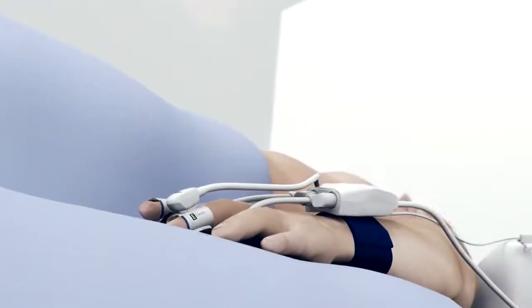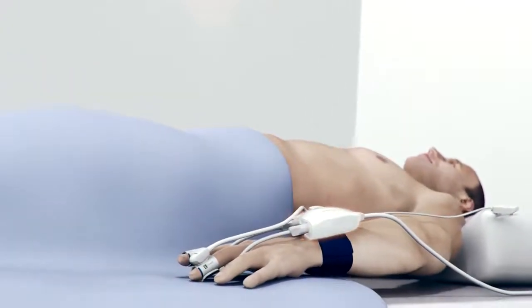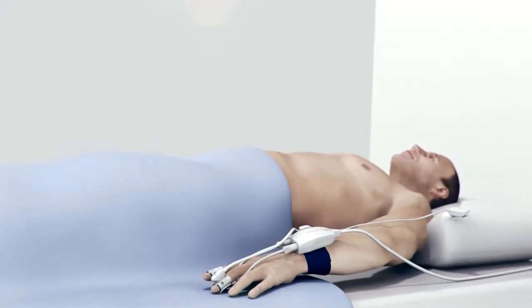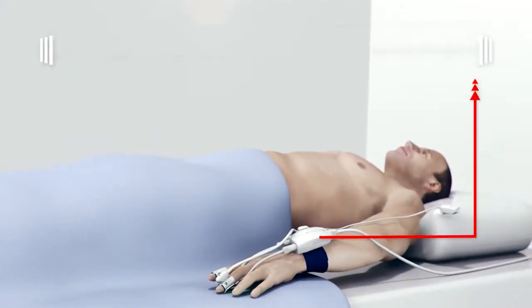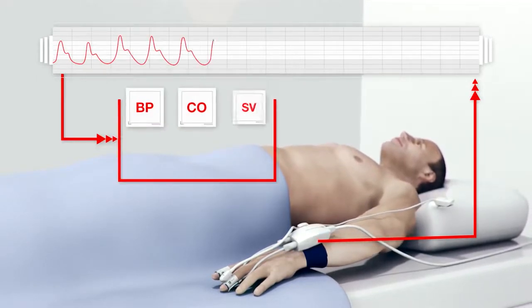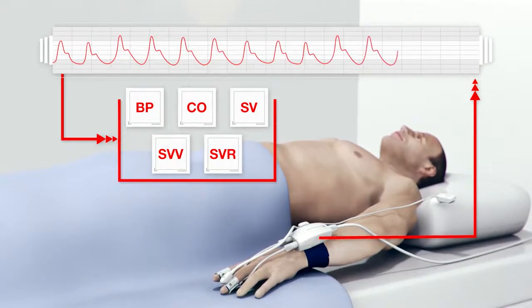The ClearSight system is comprised of the ClearSight non-invasive finger cuff, pressure controller, heart reference sensor, and hemodynamic monitor. The system provides real-time continuous beat-to-beat blood pressure, cardiac output, stroke volume, stroke volume variation, and systemic vascular resistance.